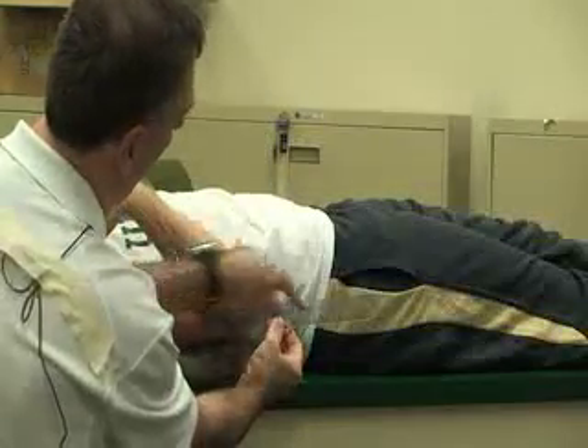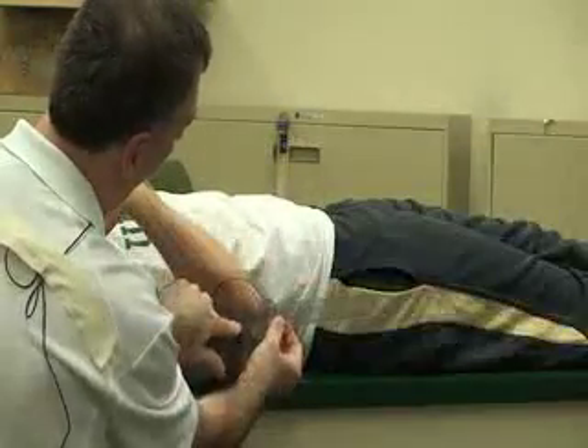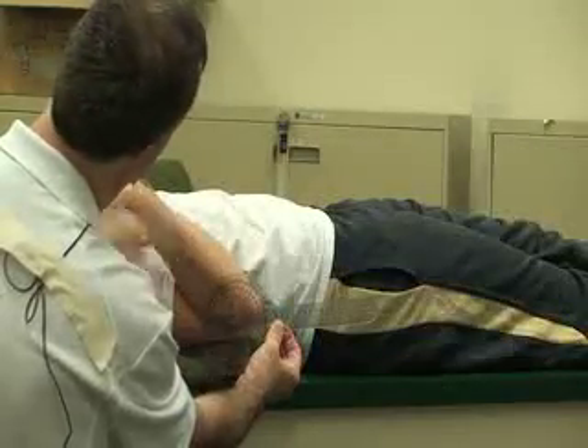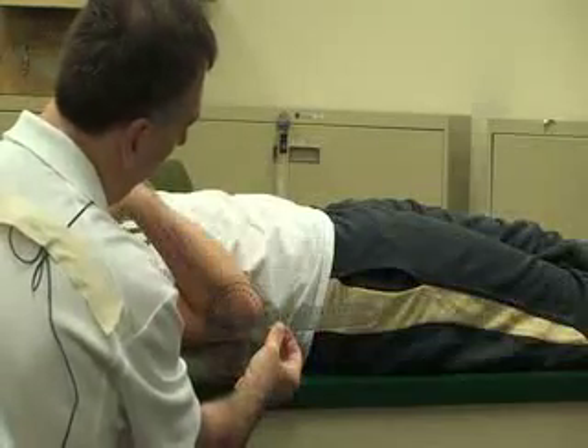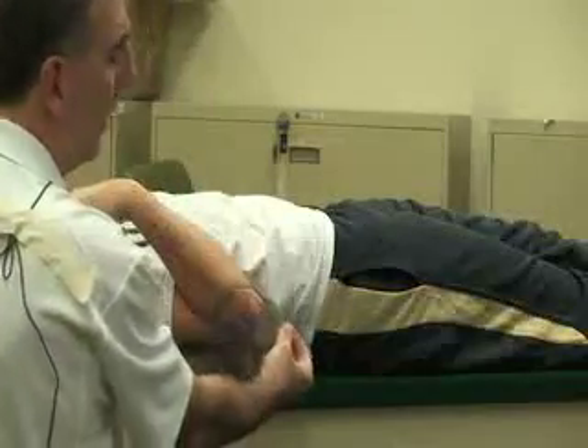At the end you just want to make sure that these are all parallel. The fulcrum is on and this is in line with your ulna, and the normal reading for this is 140 degrees.